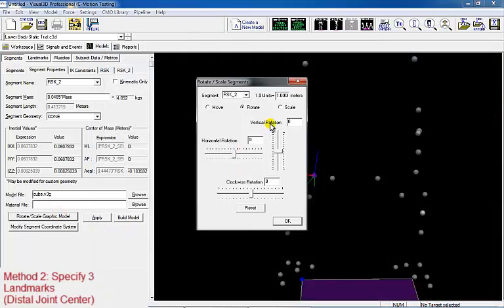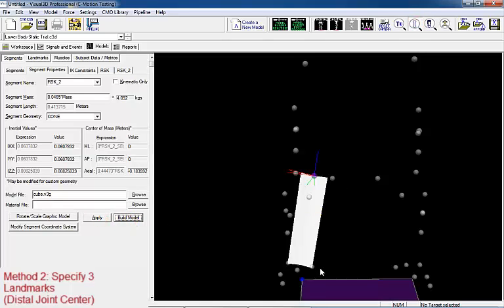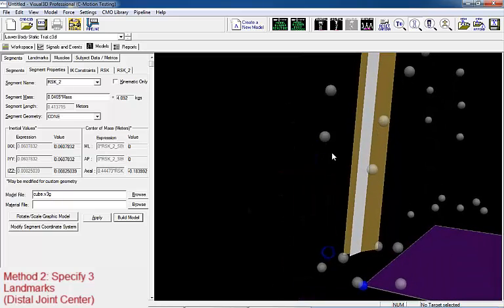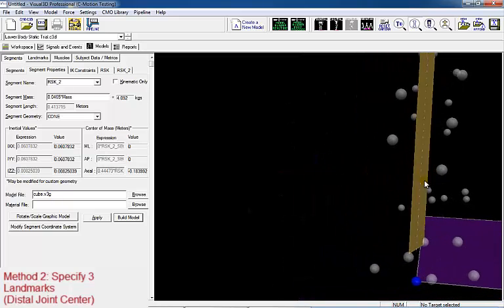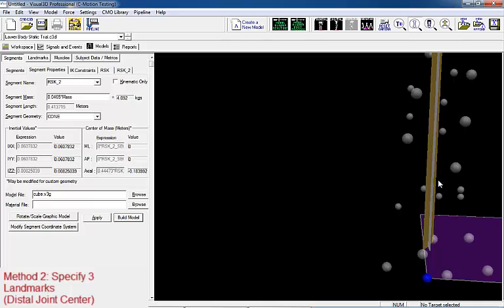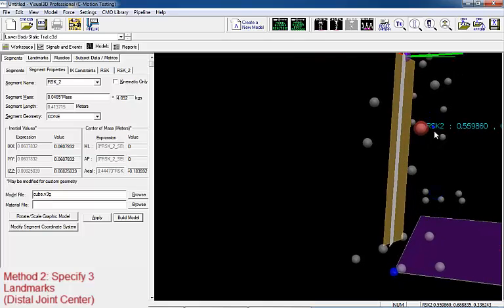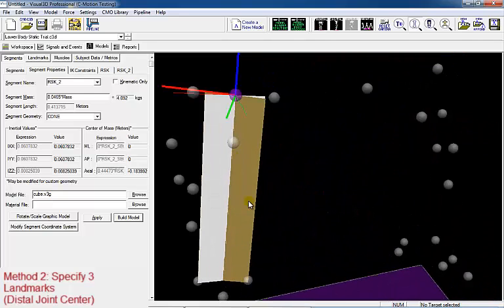By switching the graphic in the segment properties, we will be able to see the difference in the definition of the plane between our two segments. Once again, set the model graphic file to cube and set the scale width to 50 and the scale depth to 1. Apply and build your model. If we turn our skeleton on and zoom in on the shank segment, we are able to see the new plane that we created. Now we can see this anatomical plane is aligned with the lateral and medial ankle markers, and when compared to our first shank segment, the x and y axes are externally rotated along the z axis.